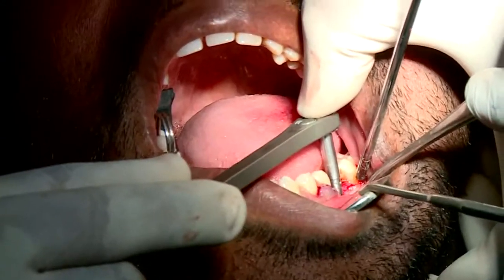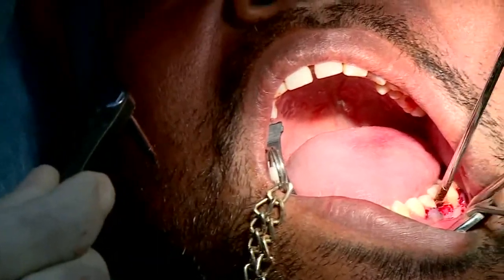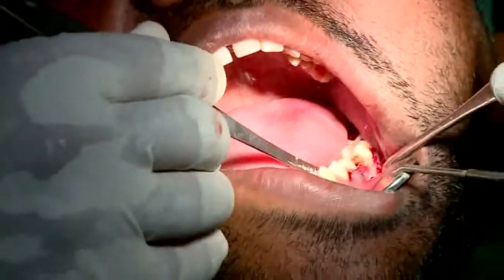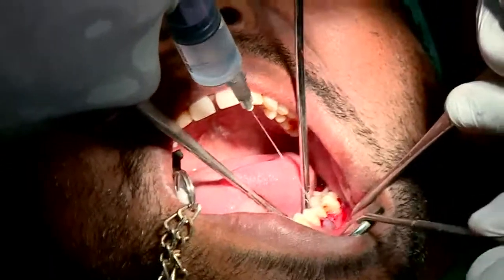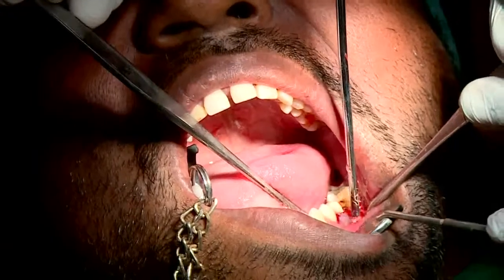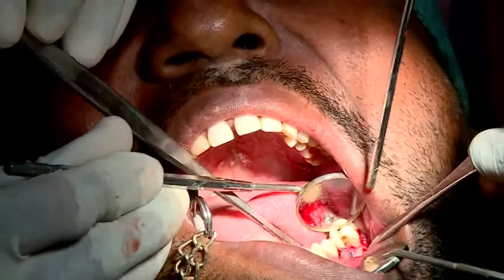You know this standard implant, what sir is trying to place inside the patient's bone, it comes with the implant fixture and the abutment. Implant and the abutment both come with the standard. But in the platform, the platform on the implant head is going to receive the abutment. Both are the same diameter.